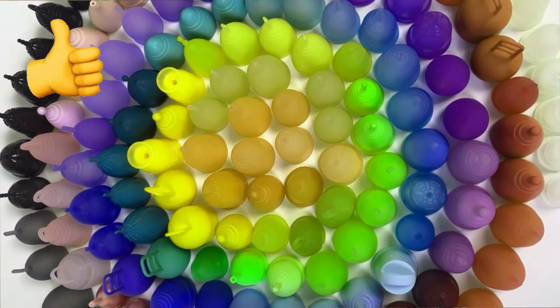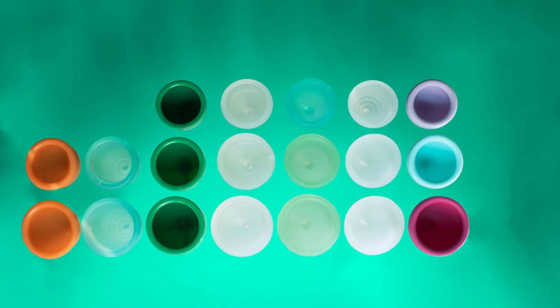Another pro column is that there are so many choices of menstrual cups and the different brands and their sizes and their designs and who they work for, and that's really the most important thing. You can find a menstrual cup that's going to work for basically every single anatomy type. You've got the basic Diva cup, which fits a lot of people, but it's a little long, so maybe a high cervix cup. You've got the Kind cup, which has a very ergonomic shape. You've got a low cervix, high capacity cup. You can trim these off, and you have a very short but high capacity option. You've got a stemless shorter cup, which some people find more comfortable. It also comes in TPE, so if you have a silicone allergy, there are options in menstrual cups for you as well.